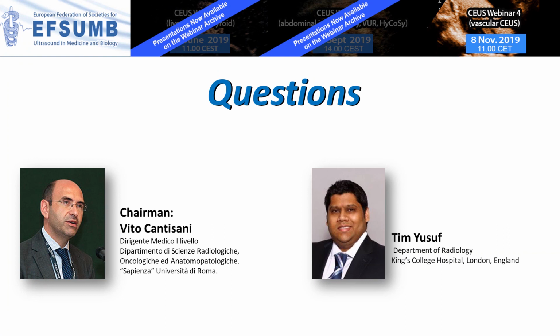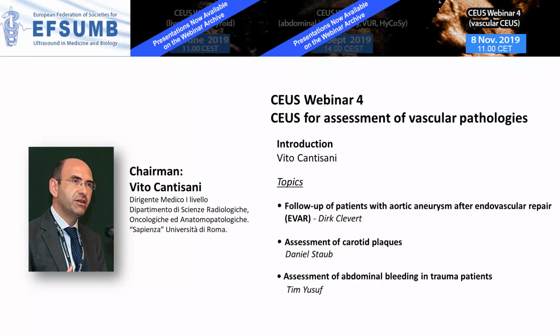So in general, to answer Matthias Johnson, dose is relative to the patient, relative to the indication, and relative to the equipment that you are using. I hope that you agree with me. Absolutely, completely. So we ended this very interesting, very promising webinar because, as we showed, CEUS has established a role in many fields.